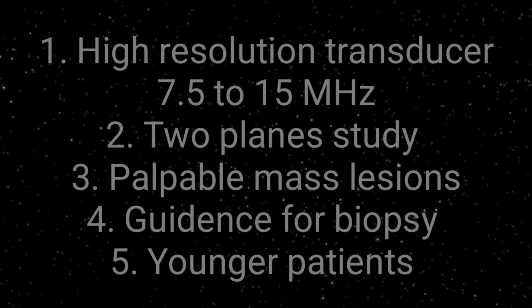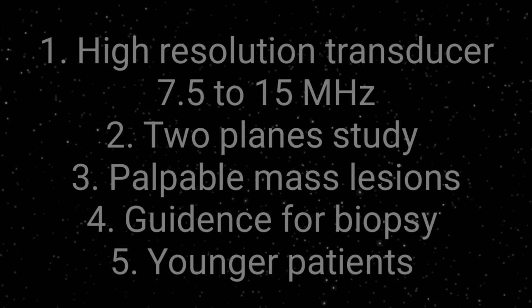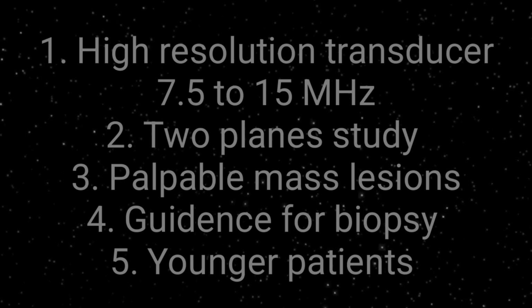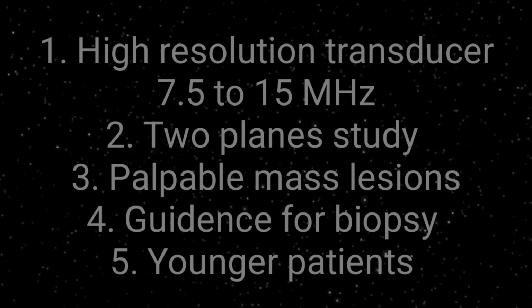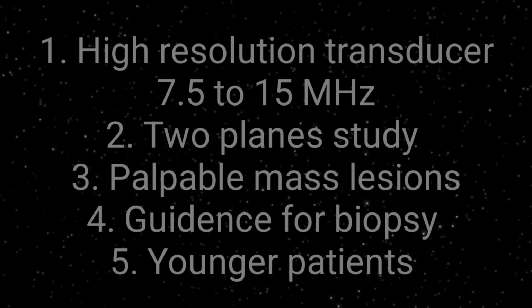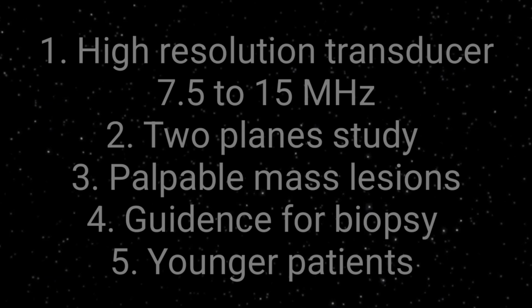For the ultrasound imaging, you should have a high resolution transducer, from 7.5 to 15 megahertz. It may range in between that, but it should not be less than 7.5 megahertz. Both standard views should be used. Two planes should be used, that is transverse and longitudinal.